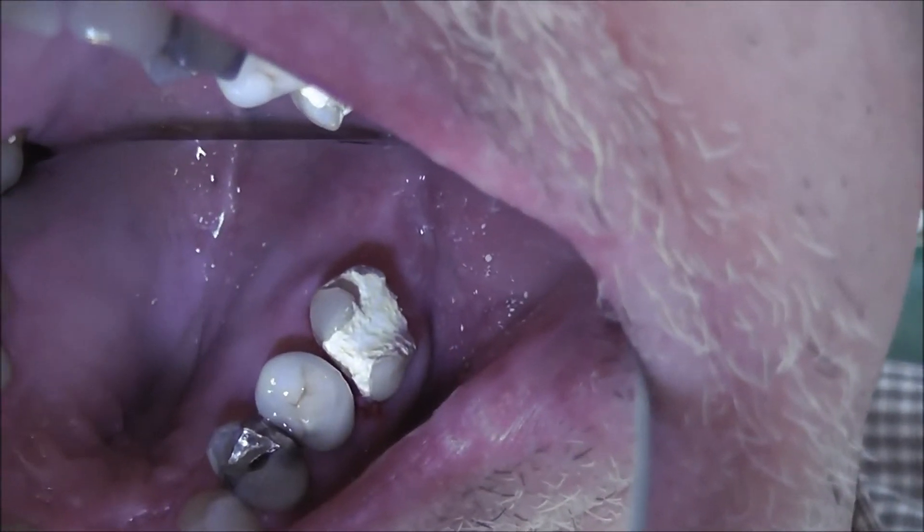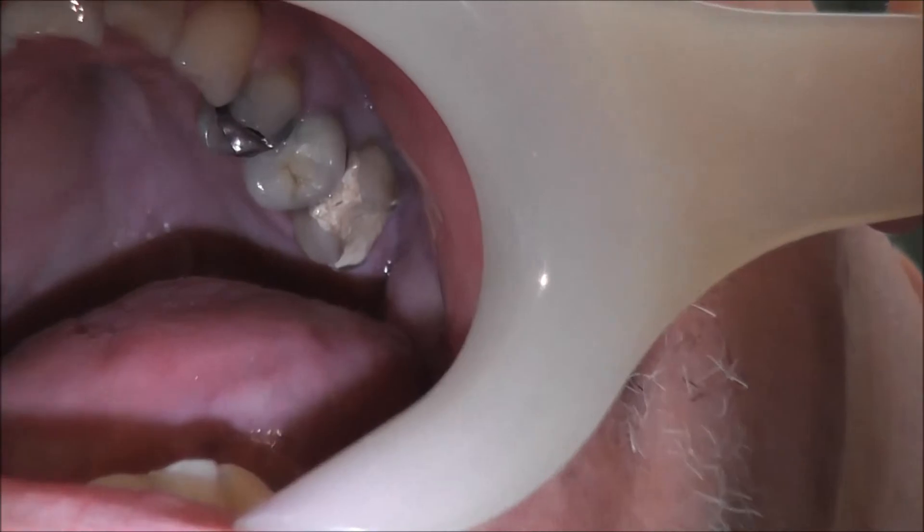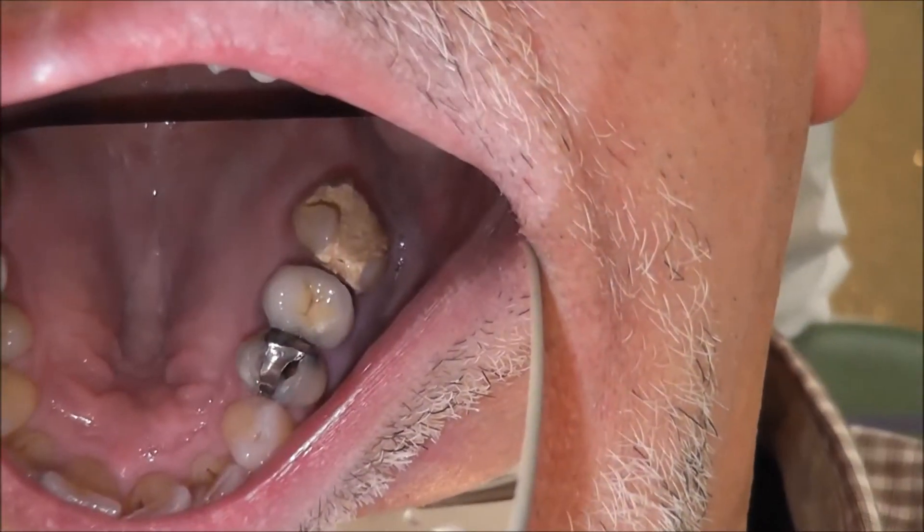The biodentine is simply smoothed and the patient discharged. The patient returned one week later and tells us that the tooth is no longer painful and there is no sensitivity.